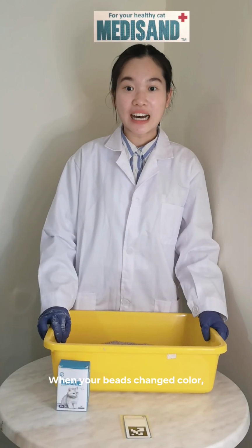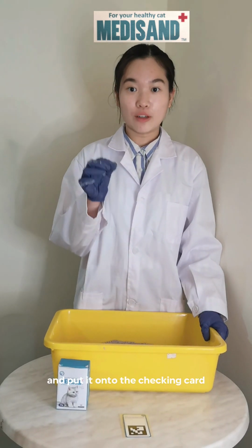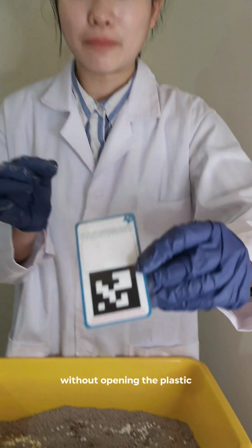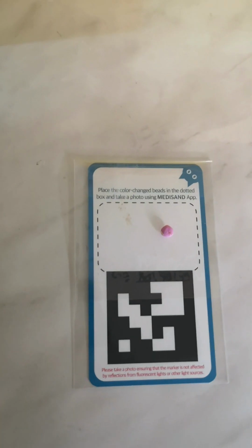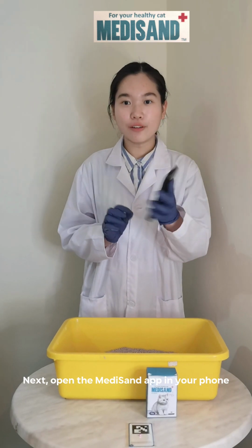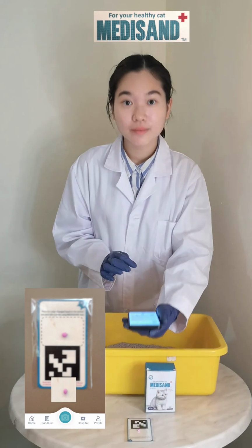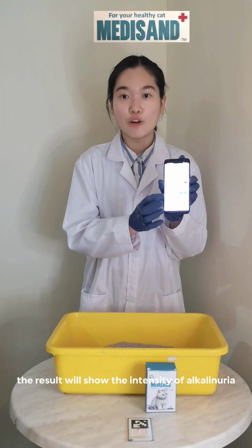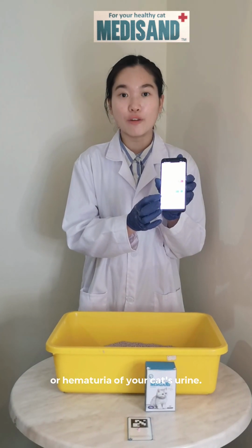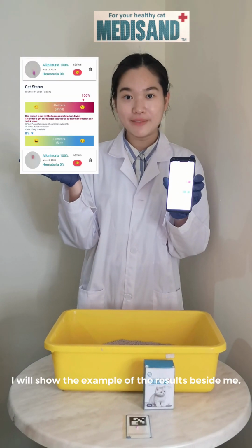When your beads change color, you will have to take one bead from the litter box and put it onto the checking card without opening the plastic so you can reuse it the next time. Next, open the Medisand app on your phone and take a picture of the result using the Medisand app. The result will show the intensity of alkalinuria or hematuria of your cat's urine. I will show an example of the results beside me.